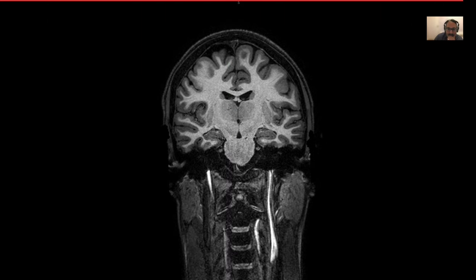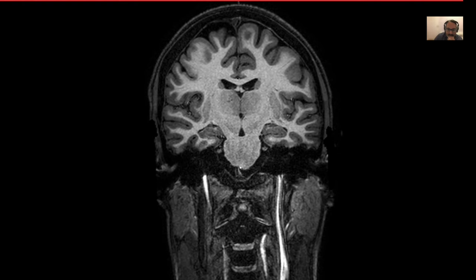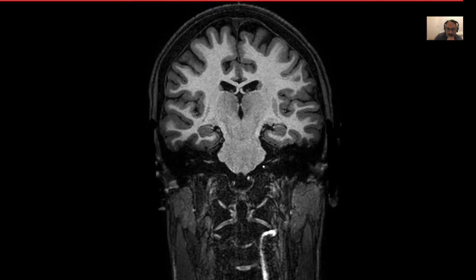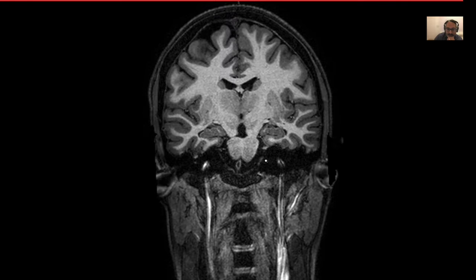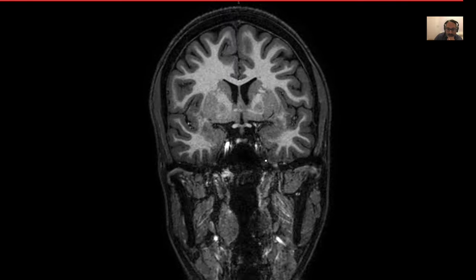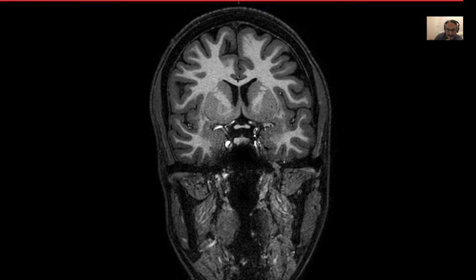What else? Let's just keep going here. A few more fun things. Here, do you see this stuff? These two things? Keep looking. And as I move more and more anteriorly, they will come together. Look at these two things over there. Move as it moves anteriorly. That is your optic chiasm.